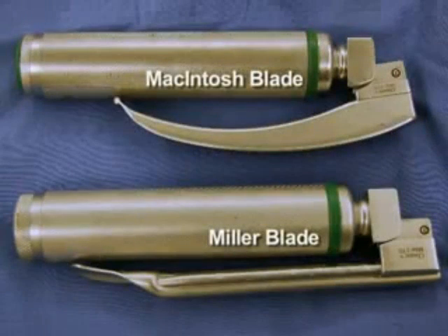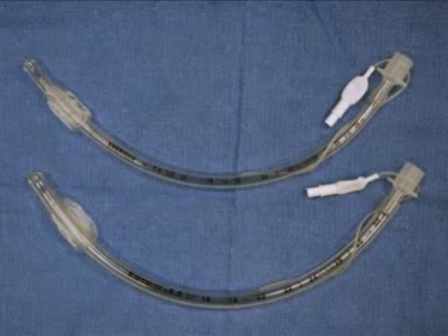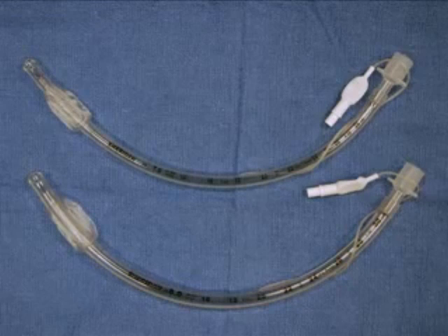Select a laryngoscopy blade based on your experience, airway exam, and patient anatomy. In most situations, the glottic opening can be successfully visualized with a Macintosh or a Miller blade. You will also need to choose an appropriately sized endotracheal tube. The majority of female patients will use a size 7 tube, and the majority of male patients will need a size 8 tube.